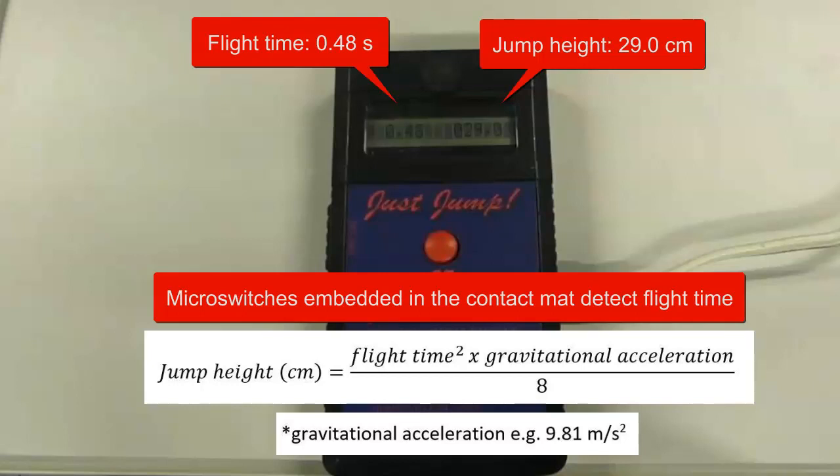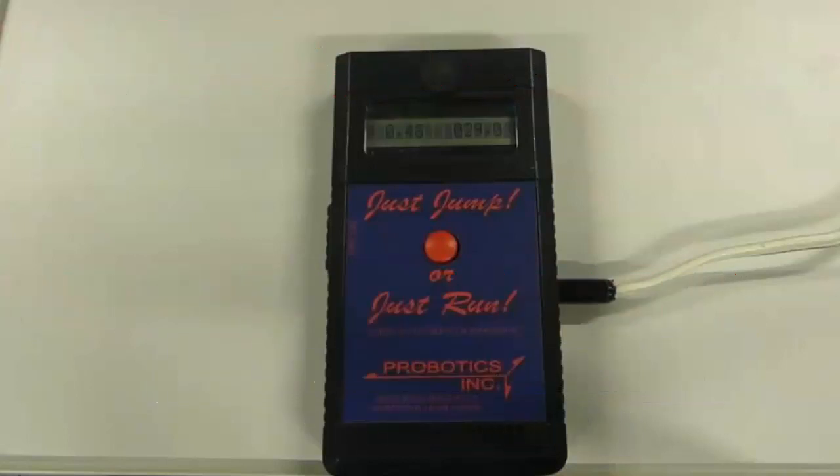You can notice that the result provided seems higher than what we just watched. I'm not particularly good at jumping and I don't think I jumped 29 centimetres. It had been noted by a few colleagues that the calculated jump height appeared higher than visually observed.